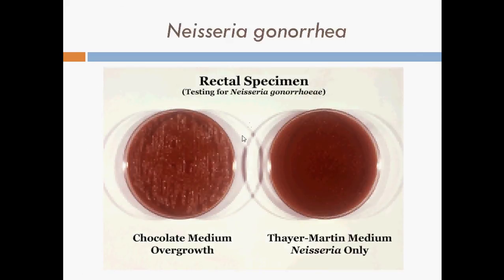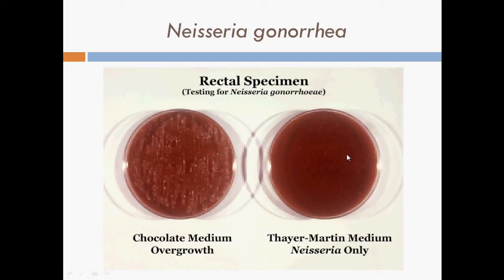Here we have two plates. One is a chocolate medium on which many different types of bacteria are growing. Next to it is the Thayer-Martin media, which only contains Neisseria gonorrhoeae in this case, because Thayer-Martin media is selective for Neisseria gonorrhoeae by suppressing most other bacteria and possibly yeast as well.